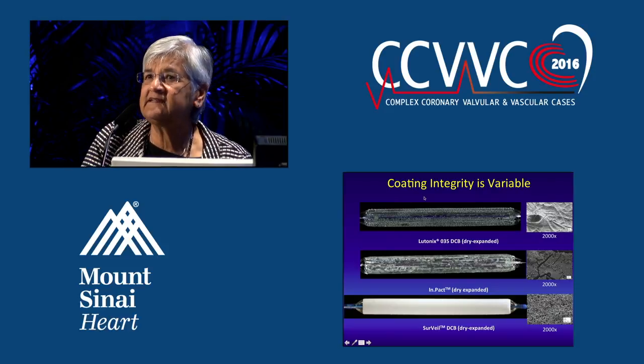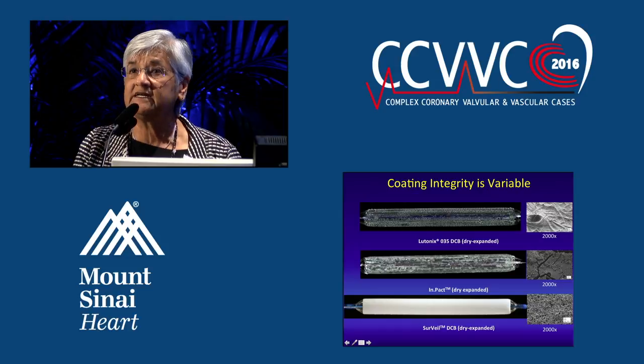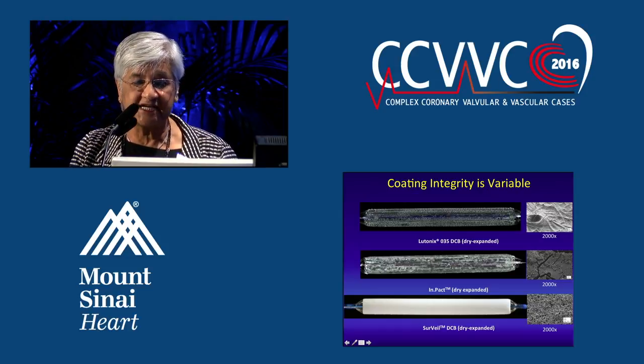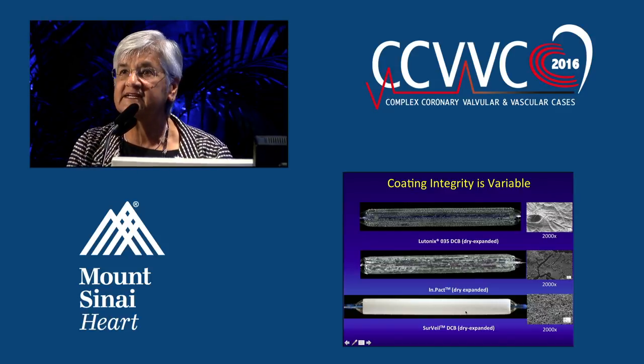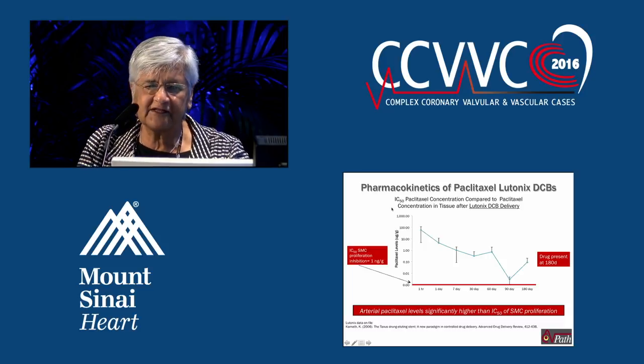So the coating integrity, I think, is very important. If you look at the Lutonics, you can see very nice coating, whereas if you look at the Impact, you can see that it is quite powdery, and if you look at the Surveil, it seems very smooth, and surface coverage seems quite extensive, as shown here. And the integrity, and I'll show you the pharmacokinetics.